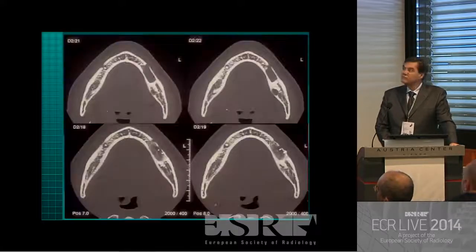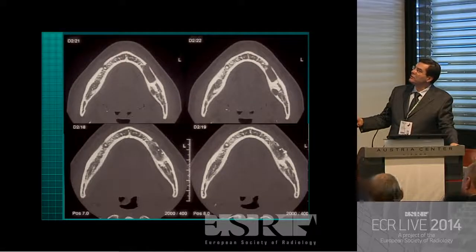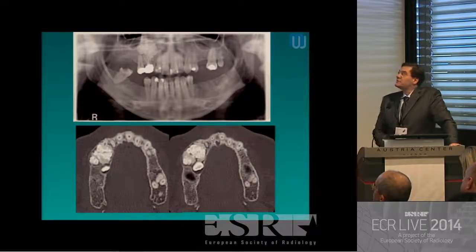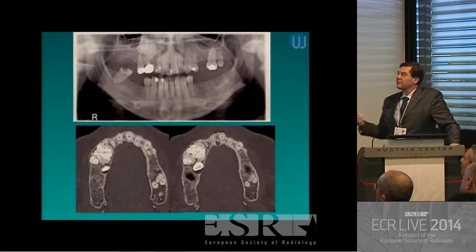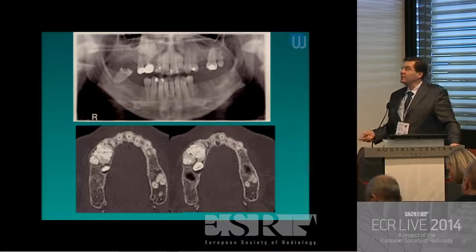After treatment of such a cystic lesion, we can also see how the process of regeneration, of mineralization, takes place. This is prior to operation, and here you see clearly the mineralization. There's only a small rest still missing in the center before the mineralization is complete. Tumorous lesions: this is a compound odontoma in the upper jaw. You can clearly see these tooth-like parts, which is a clear indicator that it's not just an osteoma or cementoma, that it must be an odontoma.